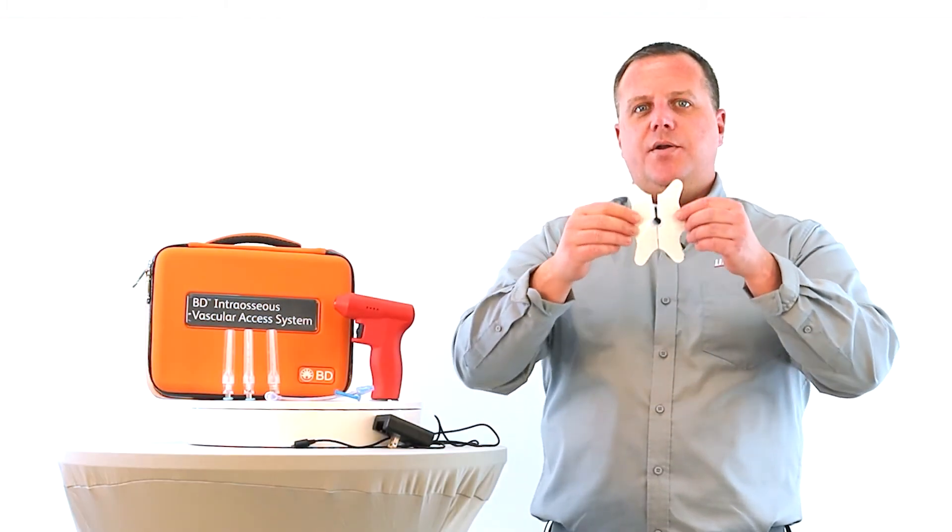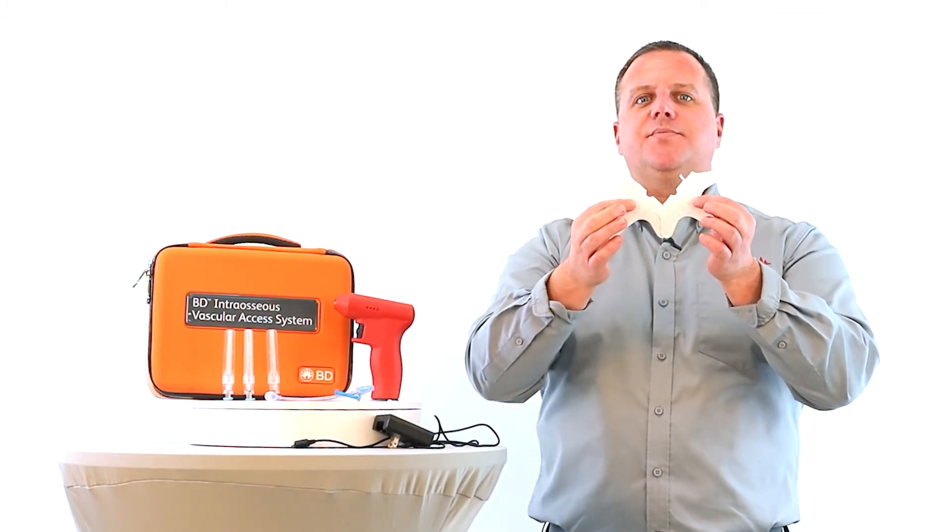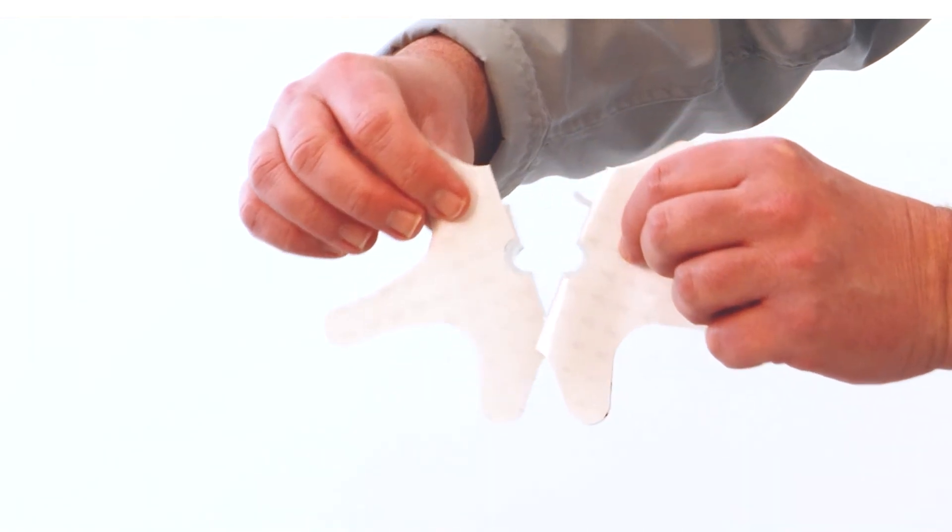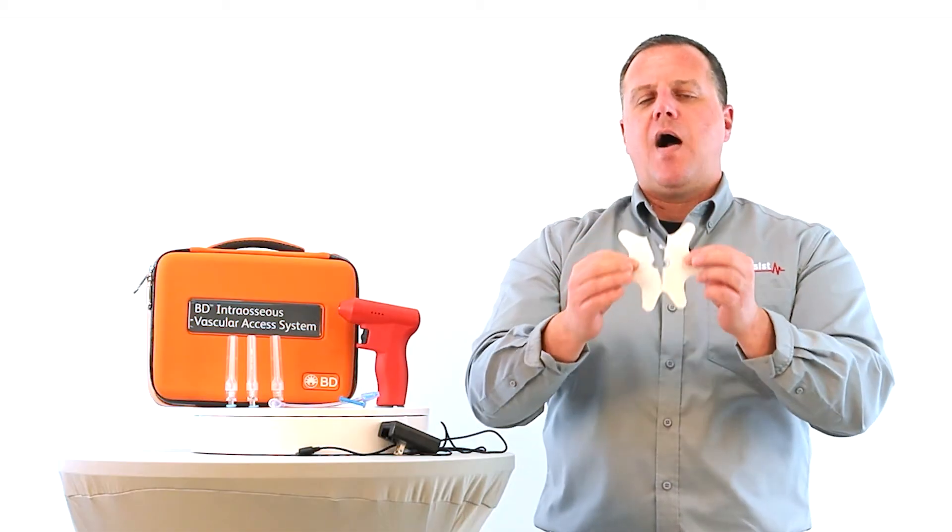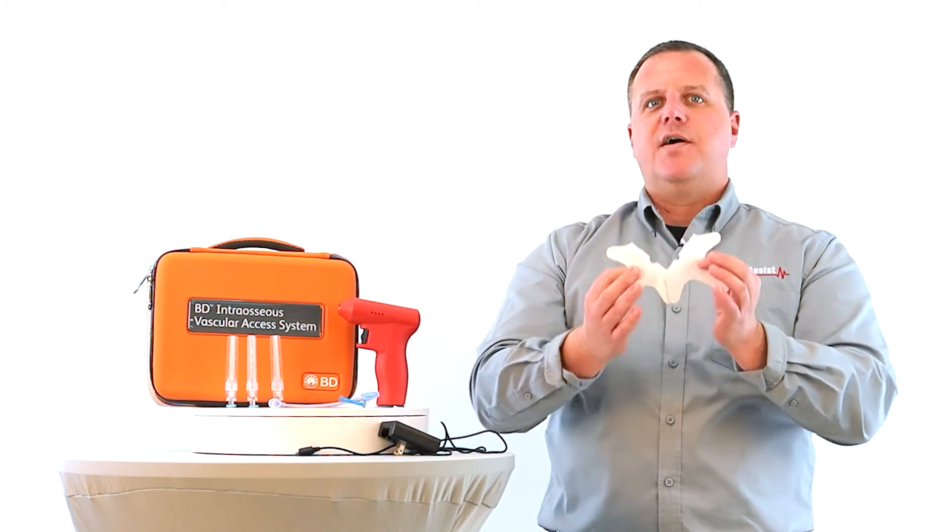The next amazing feature I want to talk about is the one-of-a-kind open clasp securement system. This basically is going to allow the end user to assure their I.O. line is patent prior to final securement.